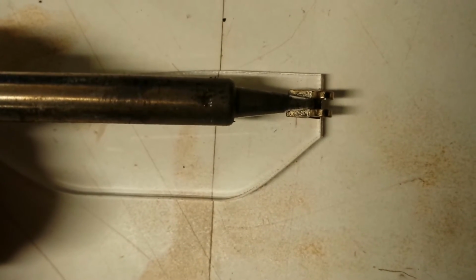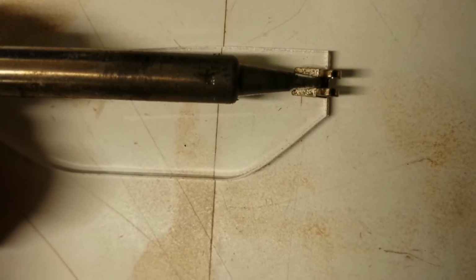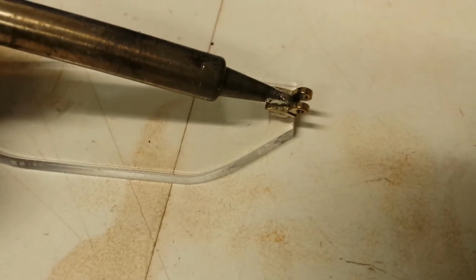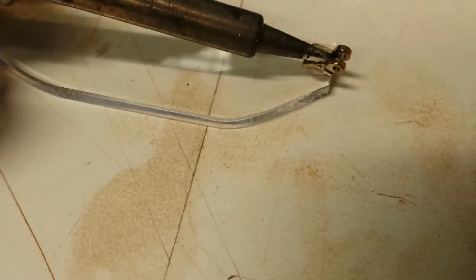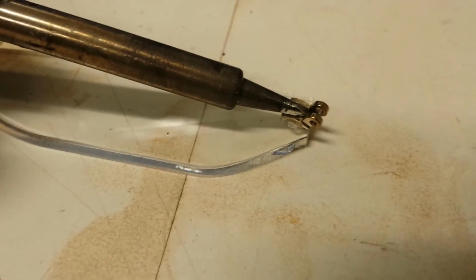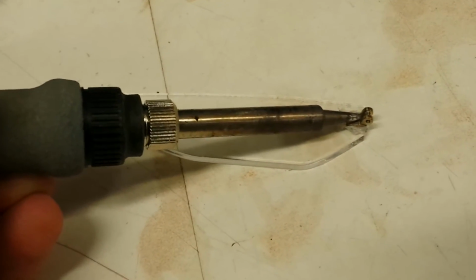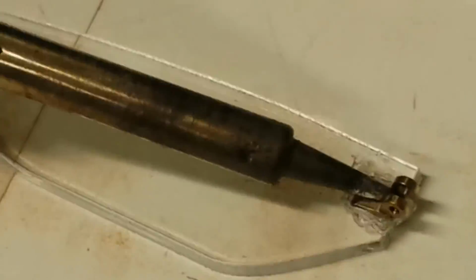Alright, so I'm holding down the hinge piece with the soldering iron, putting some downward pressure on it. Just letting the soldering iron do its work. Uh-oh, looks like things are melting and things are getting a little cockeyed here. It took two hands to get it in there just right, but by using the soldering iron, I was able to move this thing around and get that pretty much just where I wanted it. So there you go.